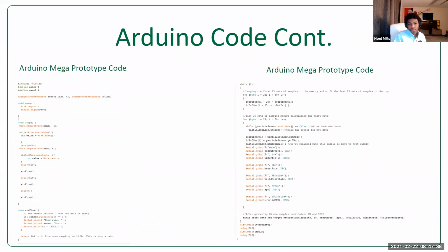And this is a continuation of some of the code. So we have the Mega, and that's supposed to say Nano on the right side, but the Mega is the master, while the Nanos are the slaves. So what ends up happening is the Mega is going to say, hey, I need some information from you. And since we're using I2C pins, we can wait for that information to be sent, versus if we were using any other pins, we would have to do a constant loop, and we wouldn't be able to see if we actually got that information or not.